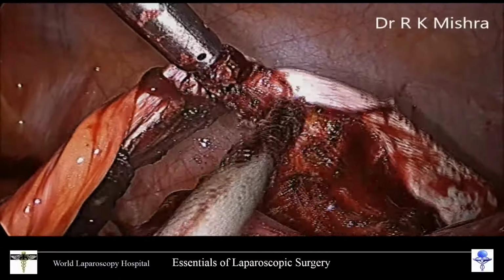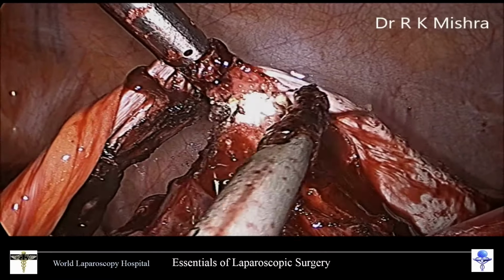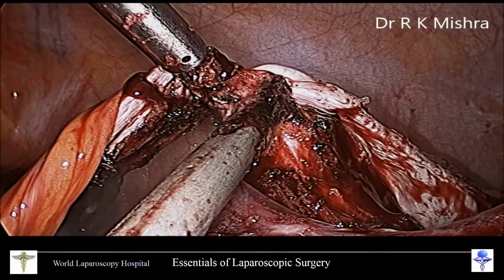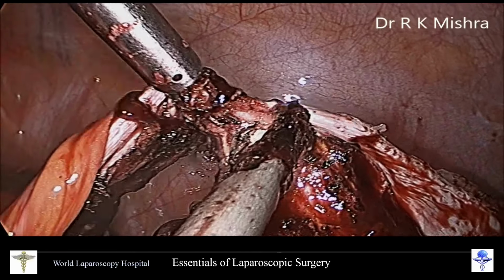Now this is the last part of attachment. You have to take consent for the colpotomy also.